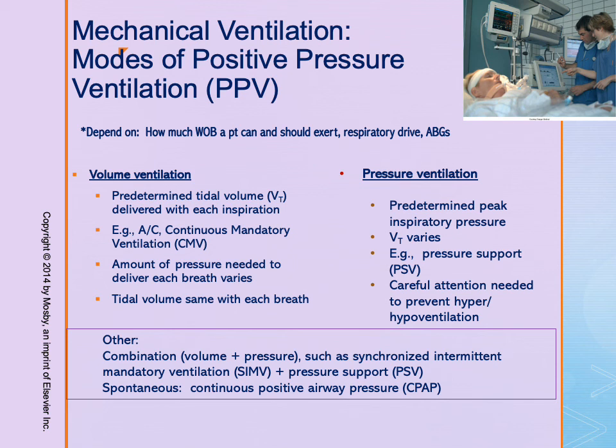of breathing. The patient will initiate or start the breath, and then the ventilator will deliver the preset tidal volume at a preset frequency or rate.